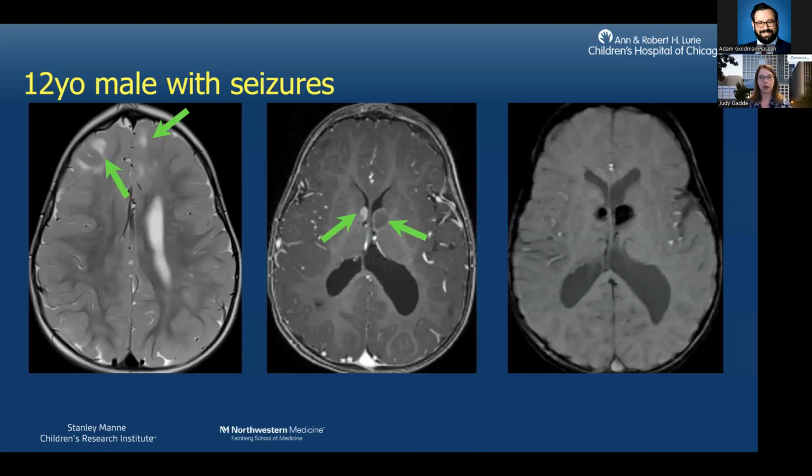which of course today is very important to try to decrease the use of gadolinium in our patients, especially our pediatric patients who are going to get multiple repeat imaging for surveillance. So just something important to keep in mind. So, if you're doing contrast for these, try to see if you can get away from doing that. And also to add on to what I was talking about for the angiomyolipomas, those can also be followed with an MR of the abdomen without contrast. So that helped when we were trying to get away from using contrast.